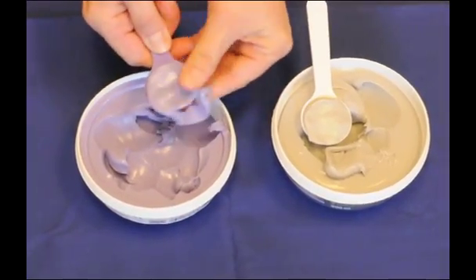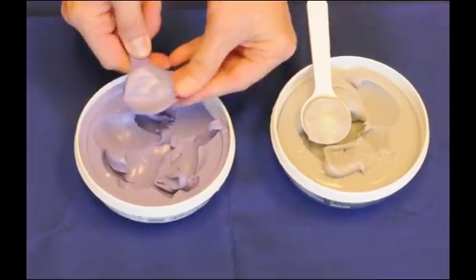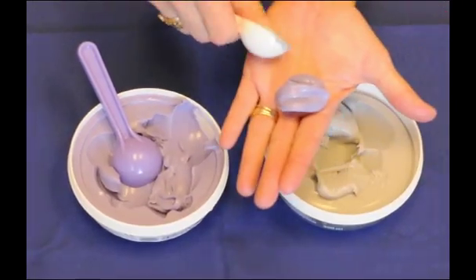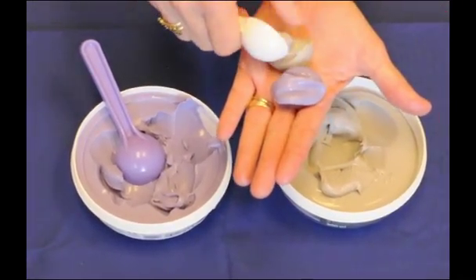So I'm using the scoops provided to make sure I do that. Once I get the level scoop, I'm going to put it out into my hand, and then I'm going to mix it in my palm, and we'll go through that mixing protocol.